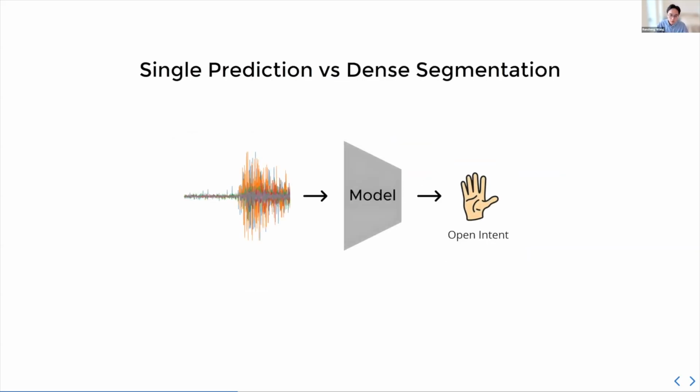So typically, when people train an EMG gesture model, what they do is they take a window of EMG signal, a short window, feed it to a model, and then the model predicts a gesture for this window, right? And we use a window as the input because a single time step of EMG doesn't really mean anything. You really have to look at the neighboring time steps to contextualize it. So a window input, single label output.